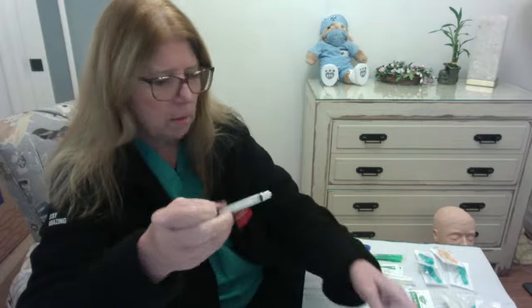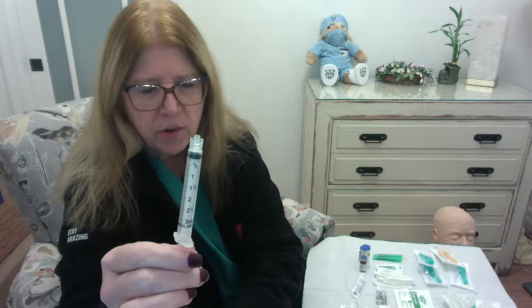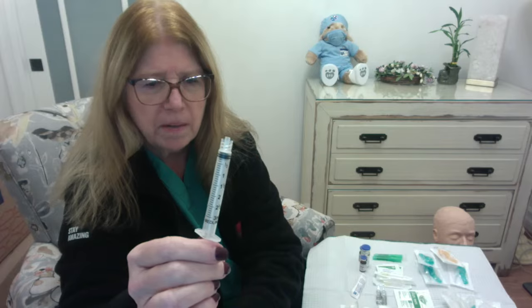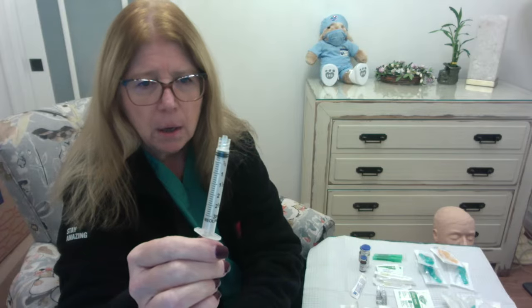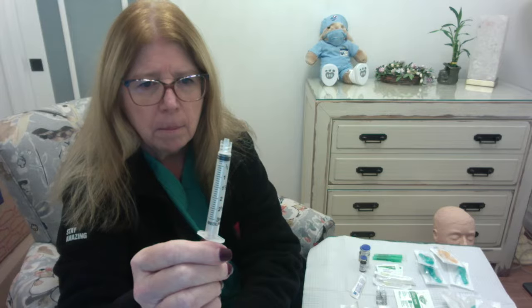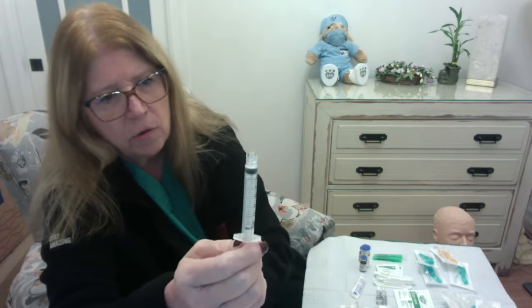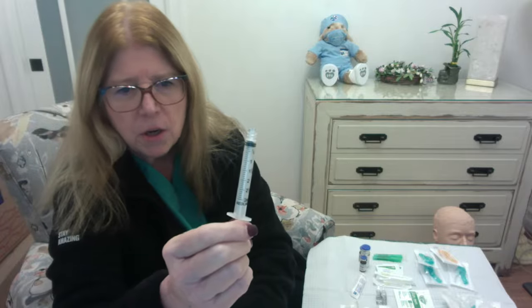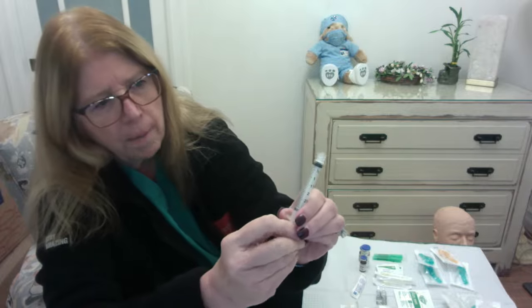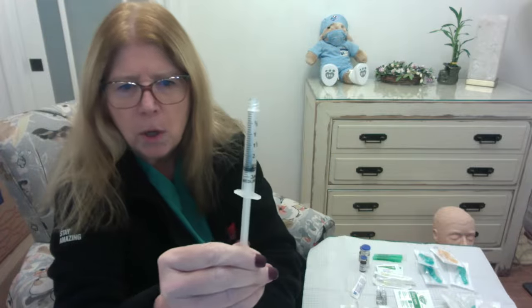So the markings that are on the barrel essentially break that syringe into smaller increments. So this 3 ml syringe is basically in half milliliter increments and also in tenths of a milliliter as well. So if I needed to, let's say, give a medication that was 2.6 milliliters, I would draw back my plunger to the one line below 2.5.